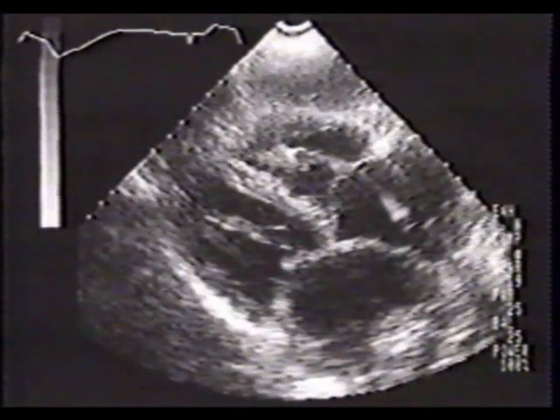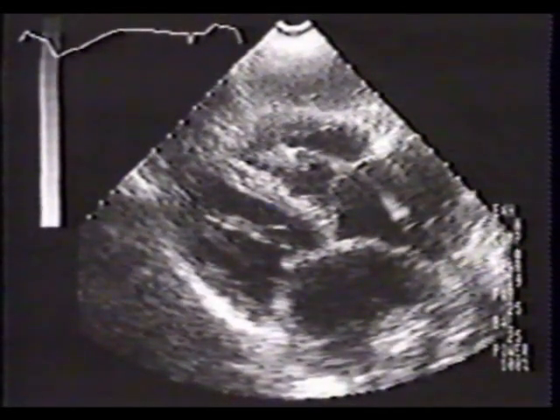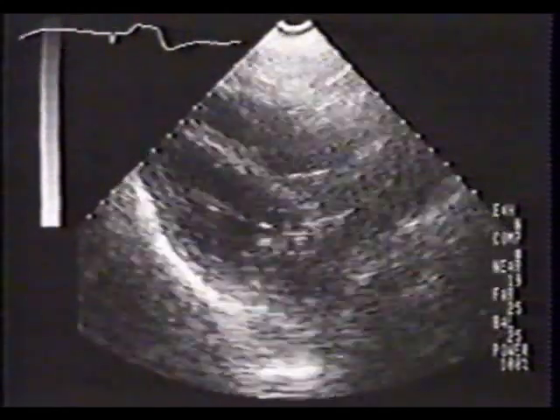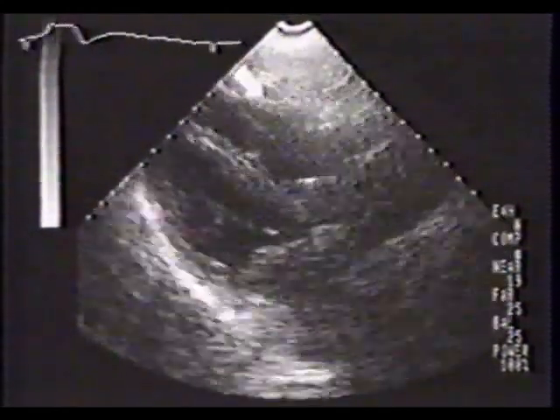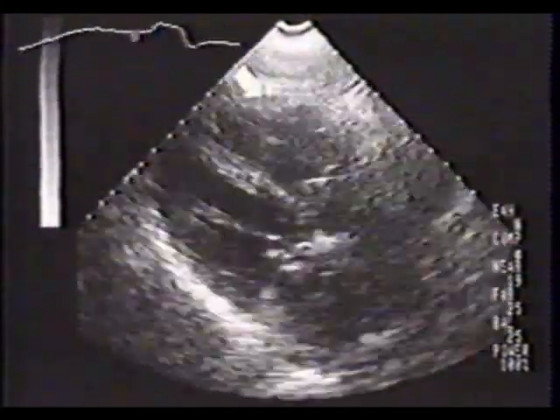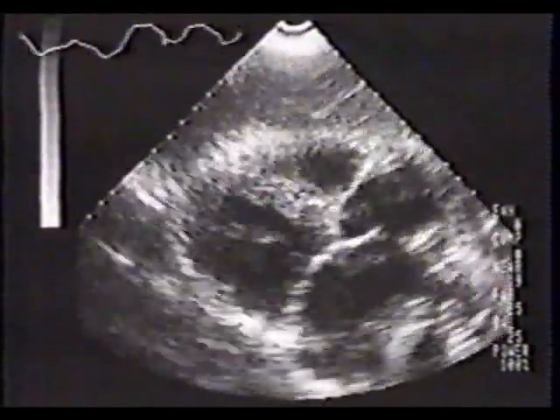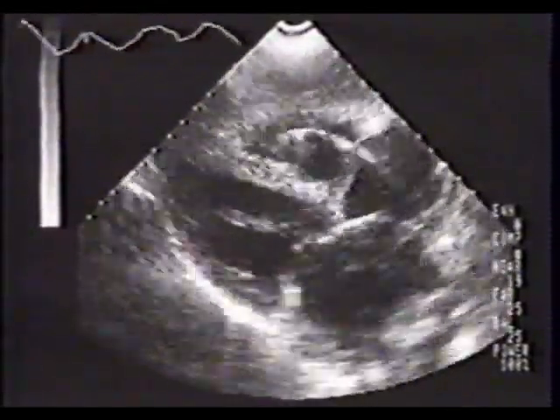This image is in 4-chamber format. This is the temporary pacemaker in the right ventricle. This motion of the image is due to chest compressions, which had been resumed. Note that subcostal imaging does not interfere with the resuscitative effort.